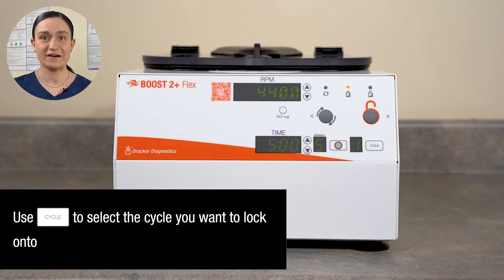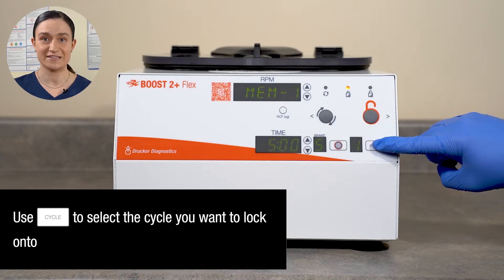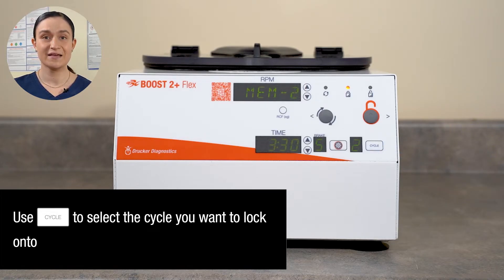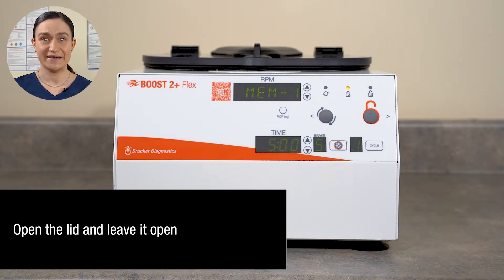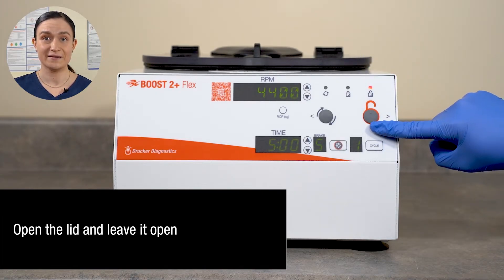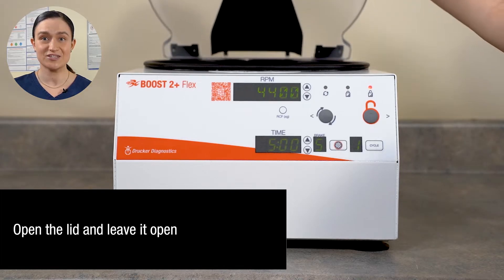Start by verifying that all the cycles you need are saved to the Boost 2 Plus Flex's memory. You can cycle through them and check their values using the Cycle button. Next, open the lid. You may need to press the Stop Unlock button if the Centrifuge Lock system is engaged.